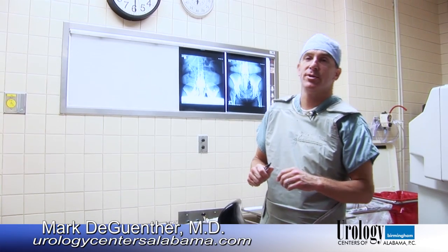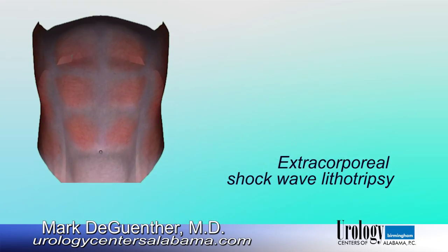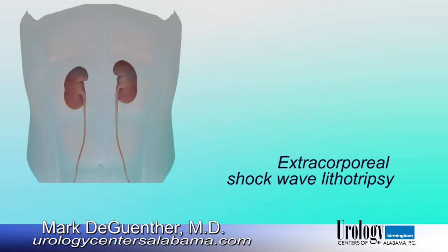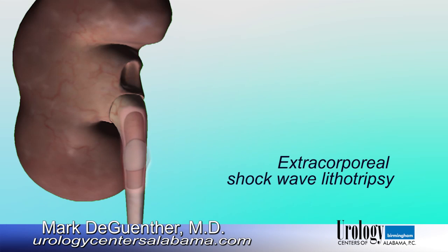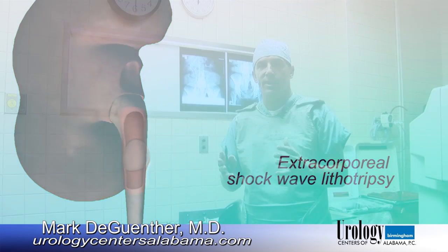Today we're going to be doing a procedure called extracorporeal shockwave lithotripsy. It is a procedure used for stones that are located high in the urinary tract. These stones are generally too big to pass or causing a great deal of pain in trying to pass, and we will then use the technology that I'll explain a little bit later to break the stones up.